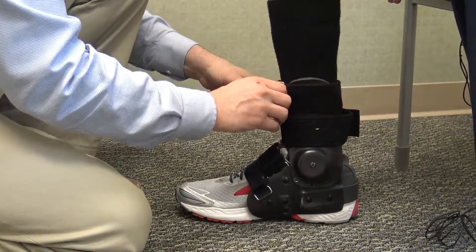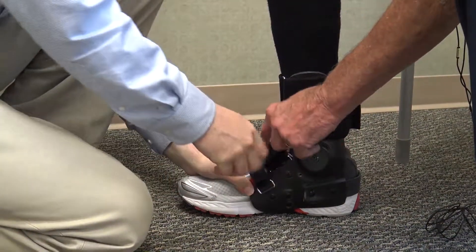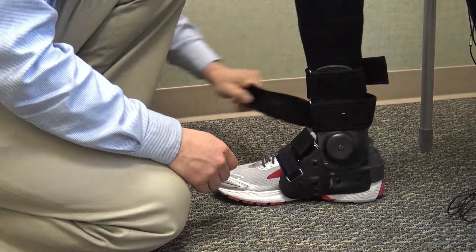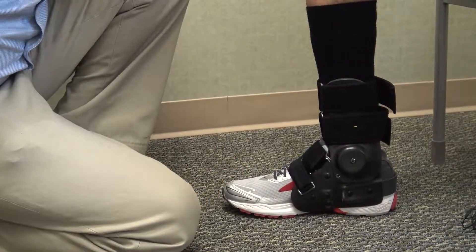Now that he's done that, he's going to repeat it once more, starting with the same number. Number one, just to tighten — two, three, four — and then have the patient walk.